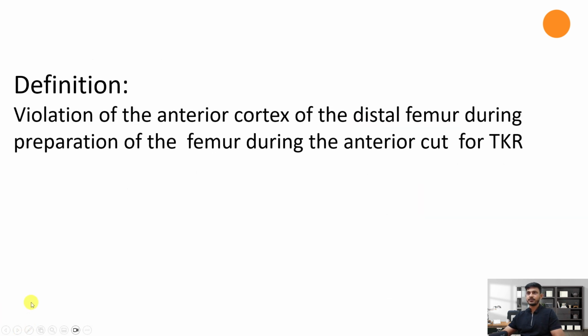I have the definition here. So it's nothing but the violation of the anterior cortex of the distal femur during femoral preparation during the anterior cut for total knee replacement.